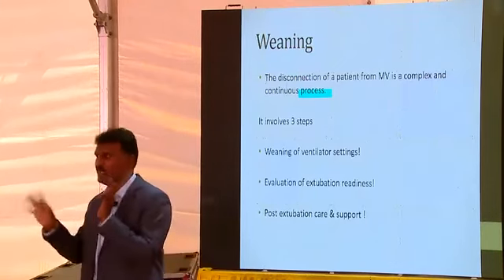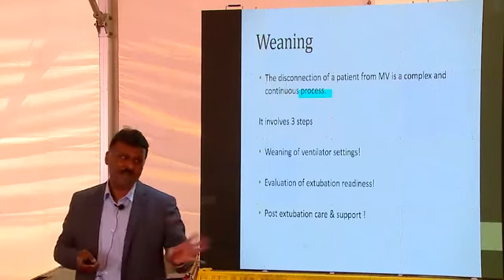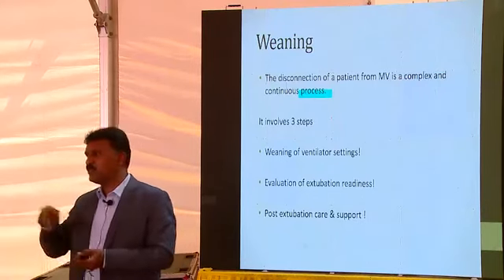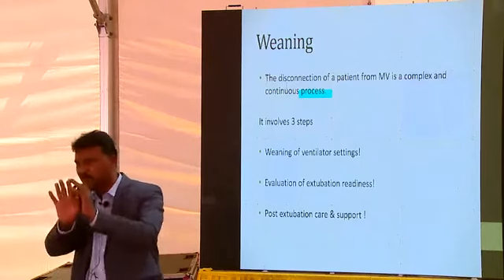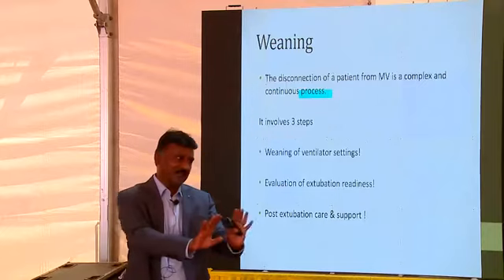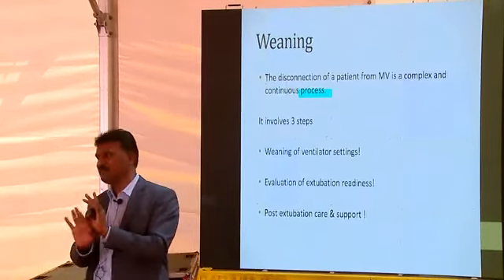The common thing is, the PG who comes to invasive ventilation just doesn't want to touch any knobs, including me as a PG. We were damn scared to touch anything, because the hell of it is, you touch something and something else happens. The boss is like, why did you do this? And so, forget it, leave it. Till next day morning, let him be safe. The baby is happy, nurses are happy, everyone is happy.